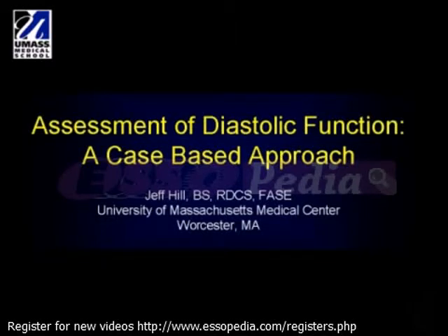Hello, my name is Jeff Hill, and I am a cardiac sonographer from the University of Massachusetts Medical Center, Worcester, Massachusetts. Today we are going to talk about the assessment of diastolic function, which will include the basic physiology, review of the literature, technical tips, and case studies.